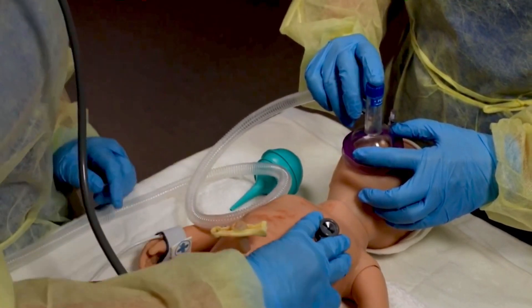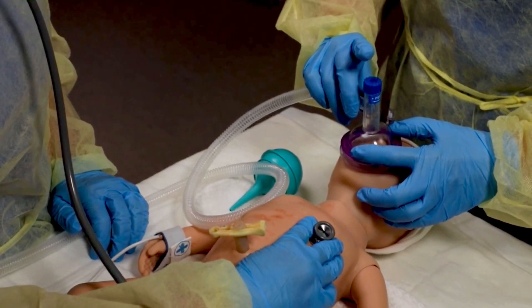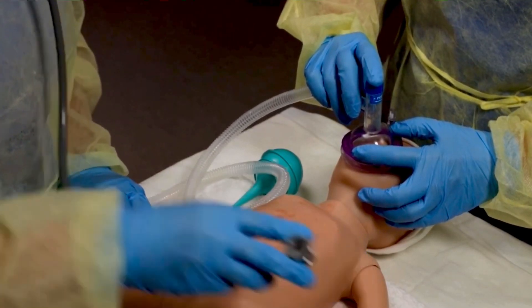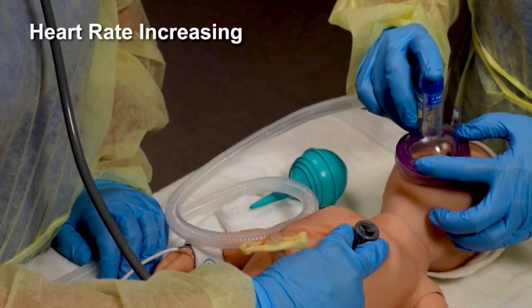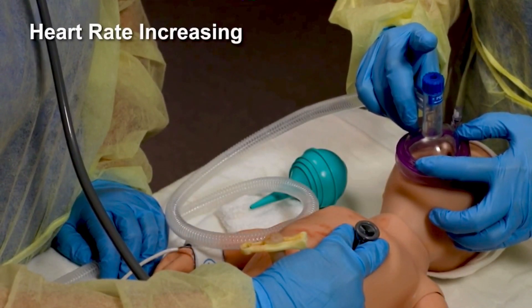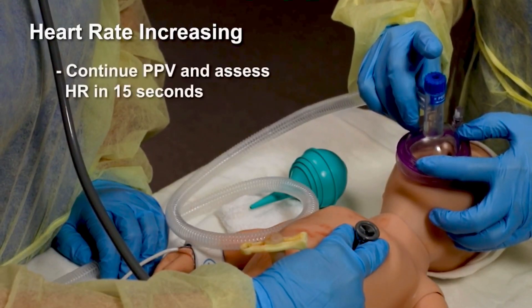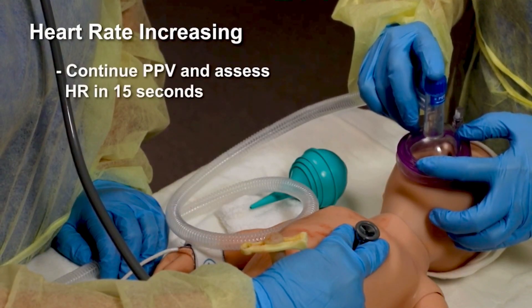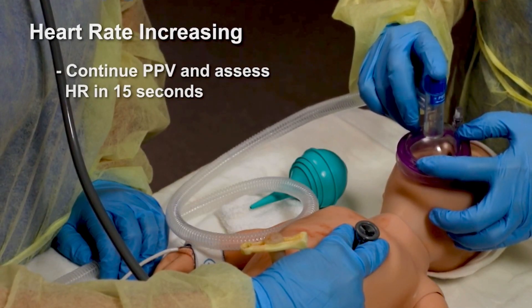Your assistant should announce if the heart rate is increasing or not increasing, and if the chest is moving or not moving with ventilation. If the heart rate is increasing, continue PPV. You do not need to do ventilation corrective steps to attain chest movement if the heart rate is increasing. Continue PPV for another 15 seconds and assess the heart rate.